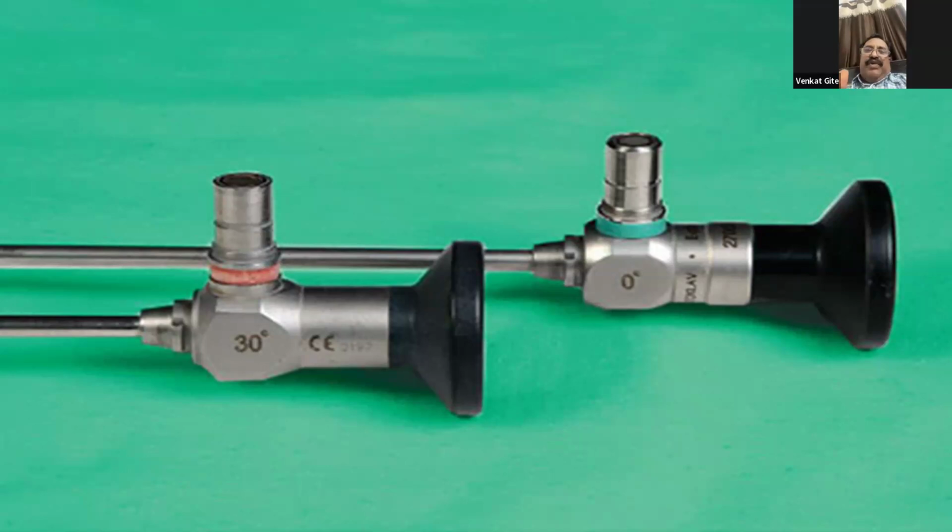0 degree means if you want to see straight front, and you don't want to see aside, then it is 0 degree. That is luminal vision. So it can be used in the lumens. Yes, sir. That means it is used in the urethra. When you want to do a scopy in some hollow organ like a bladder, you want to see on the right side, on the left side. So that is the 30 degree. Angle of vision, 30 degrees here and 30 degrees there from center.